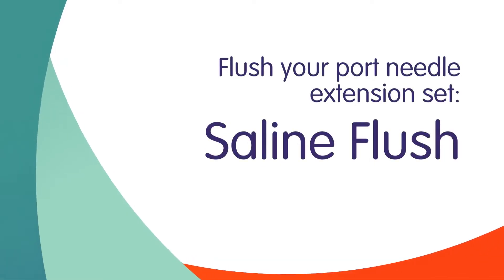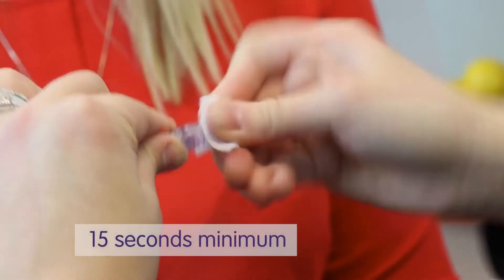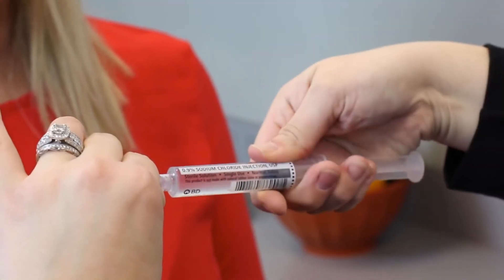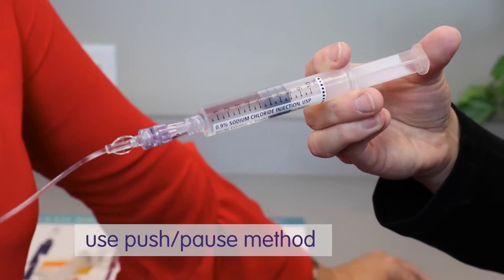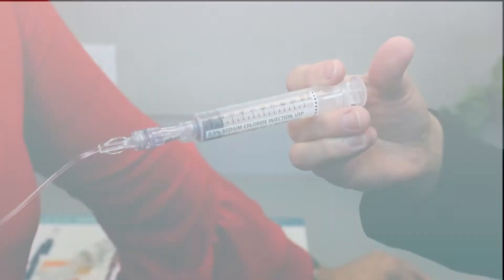You are now ready to flush the port needle extension set with saline. Scrub the injection cap for at least 15 seconds and allow to air dry. Remove the protective cap from the saline flush syringe, attach it to the injection cap, and open the clamp on the tubing. Flush tubing using a push-pause method. Do not attempt to flush if resistance is met — double check the clamp is open, then call your nurse or pharmacist. Lastly, remove and discard the saline flush syringe in a trash container.